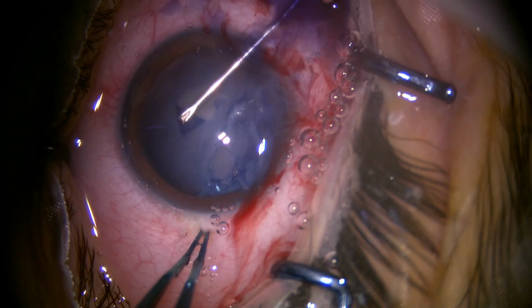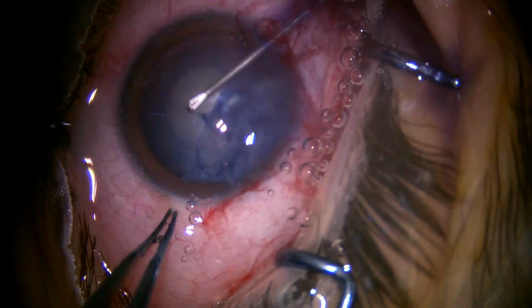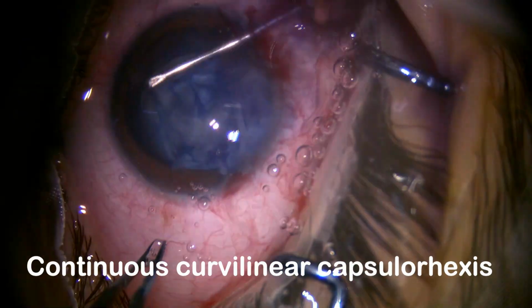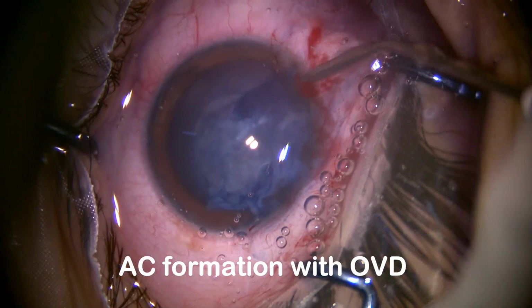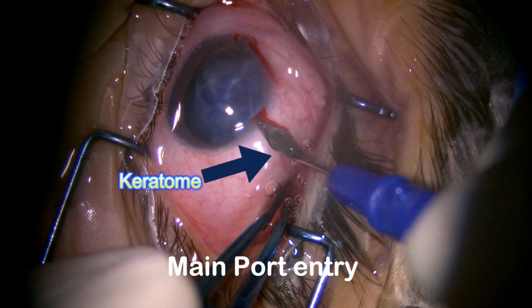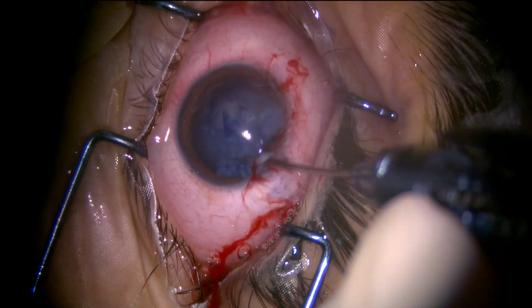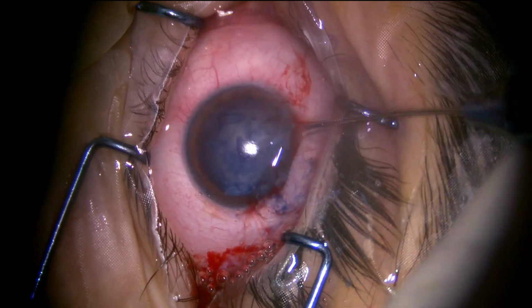After the initial steps of phacoemulsification, continuous curvilinear capsulorhexis was done using a cystiotome needle. Anterior chamber is formed using viscoelastic substance. Main port entry is done using a keratome knife by triplanar incision. Microscissors are used to make the ruptured capsule look circular.